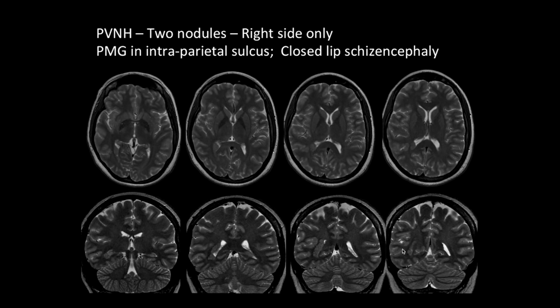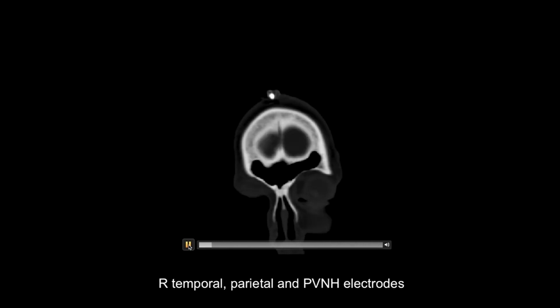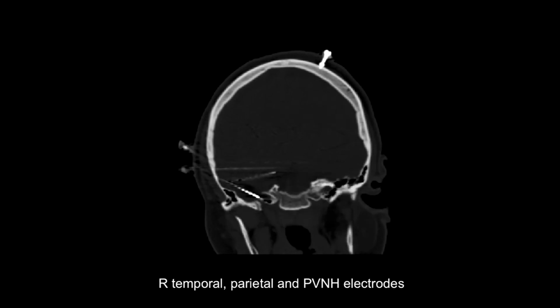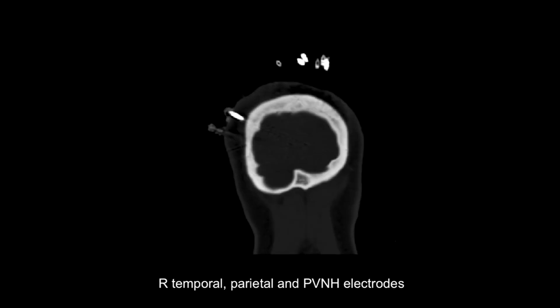So using this information, we then implanted her with electrodes. This is a little movie to show you the SEEG electrode placement in her case. Those are all the scalp fiducials, or skull fiducials, and here are all the electrodes that go into deep parts of the brain, including sampling from that polymicrogyria and the periventricular nodular heterotopia. It is important to point out that this would be an impossible evaluation to perform without an SEEG-like technique to sample multiple different deep areas of the brain.